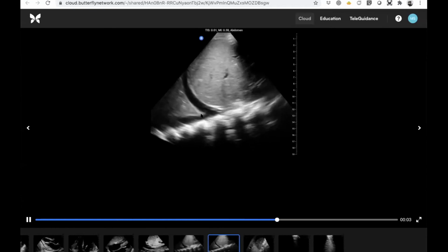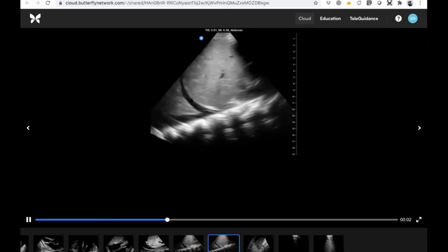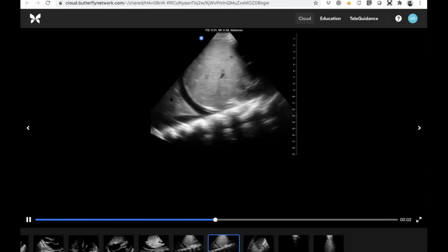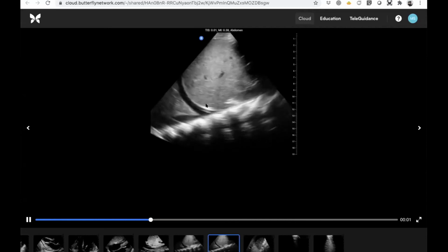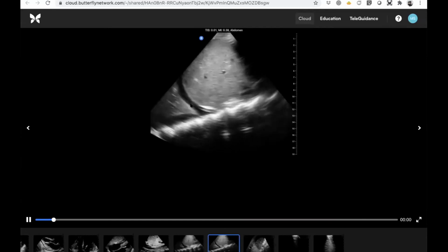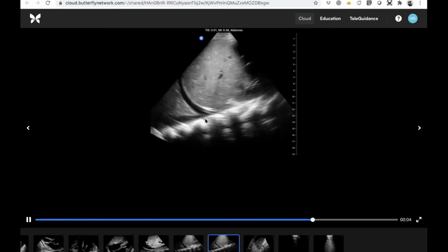And lung is here. And for those of you familiar with lung imaging, you know that lung shouldn't look like a solid organ. So the fact that it does look like a solid organ, you already know something's abnormal. And then you've got this anechoic or black collection inside the thorax above the diaphragm. The probe indicator's up here towards the head. So there's some pleural fluid in the right thoracic cavity. And then what's going on down here?